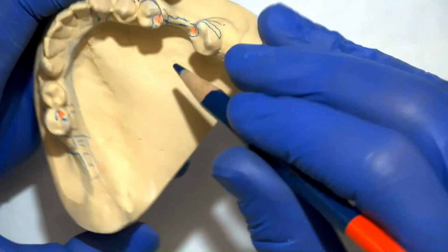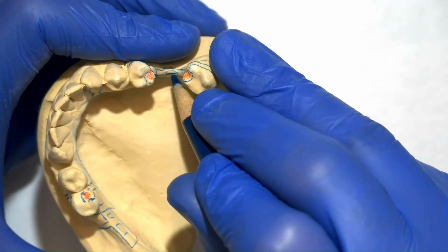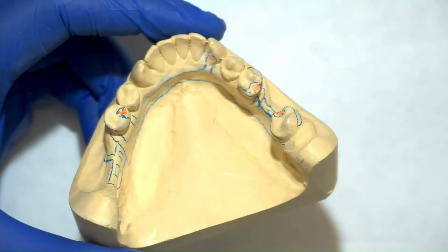On the other side, we're just going to go ahead and draw a line along the crest, and then we're going to draw that opening representing the lattice. On the other side, we've got the openings as well.